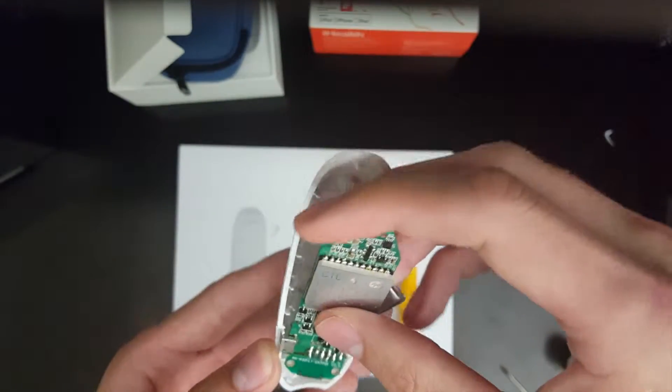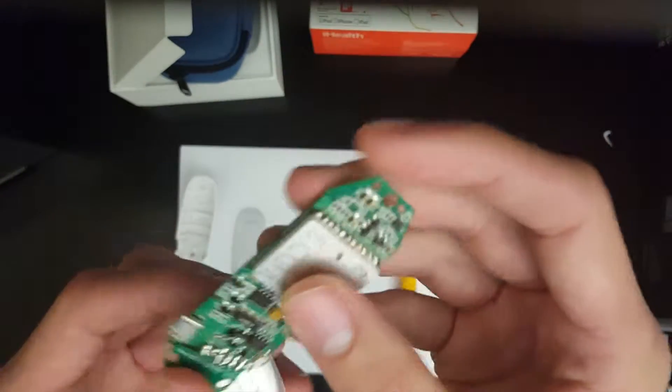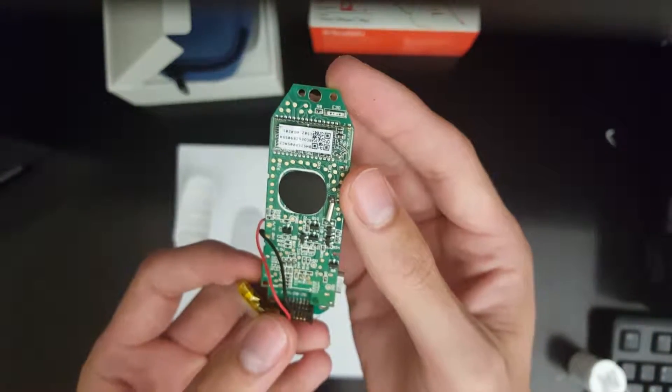We can now take the circuit board out of its main casing. When we turn it around, we see that the Bluetooth antenna is located here, which allows the device to wirelessly communicate with our smartphone devices and transfer data. Right next to it is the thermistor, which is a resistor that is affected by temperature and allows the device to gauge the temperature of the environment to determine if the readings will be accurate.